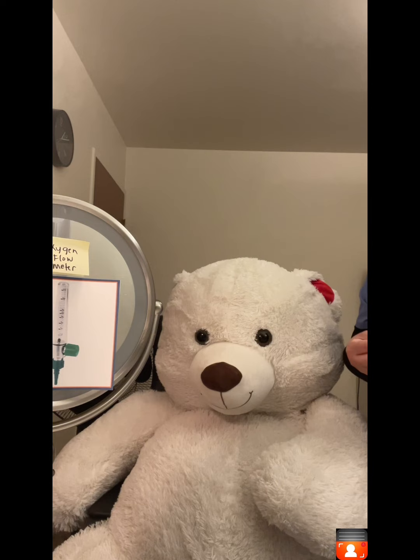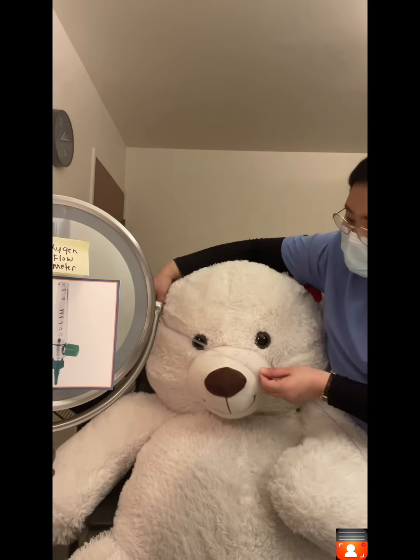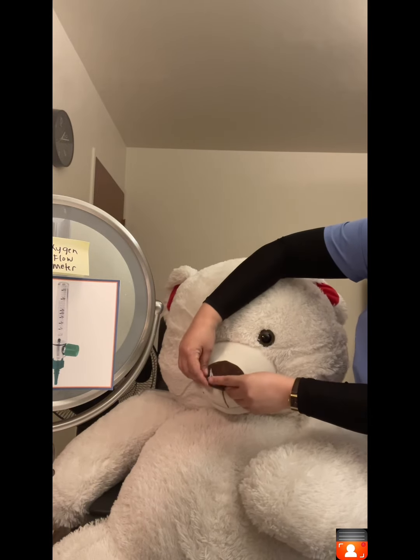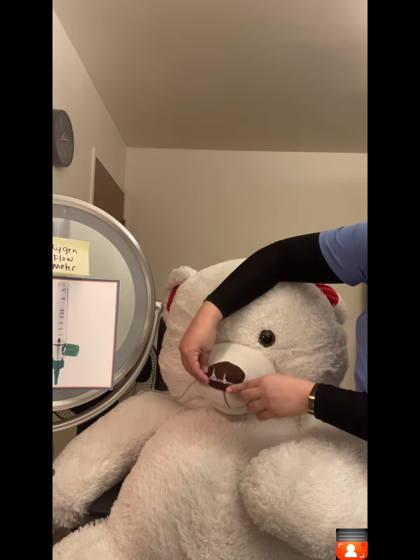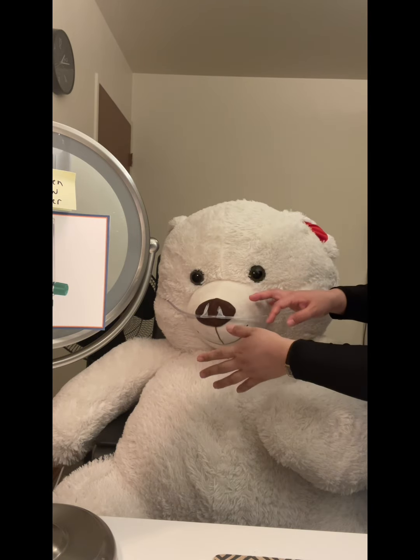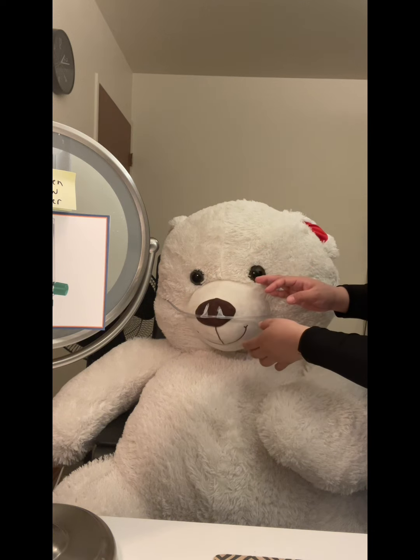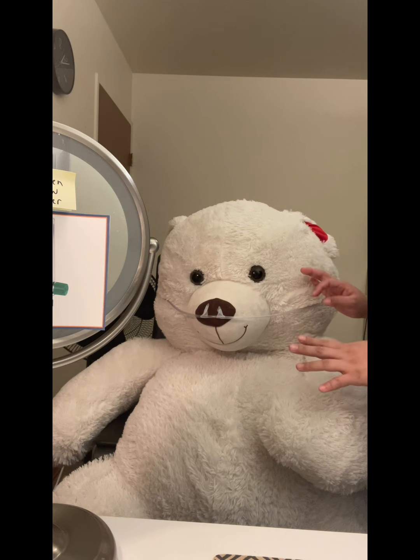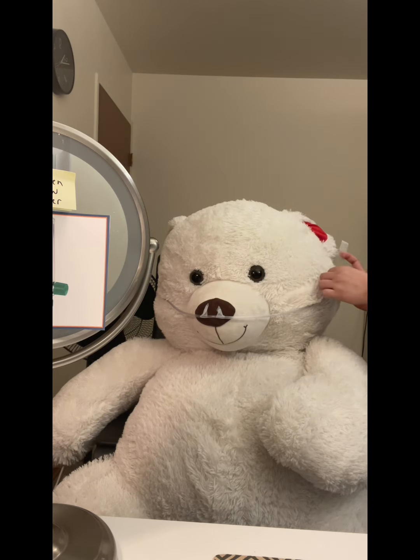In this case, I'll be using a nasal cannula. So I'll put the cannula over the client's face, like this. And then I'll make sure that the prongs are facing upward when inserted into the nose. And if the cannula will not stay in place, I'll secure it with tape at the side of the face. So I'll put tape on the side of the face.